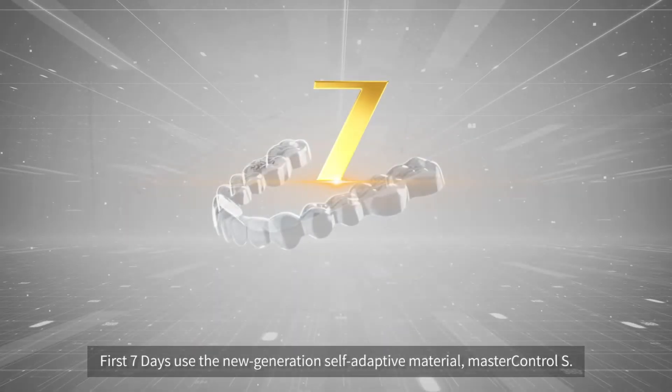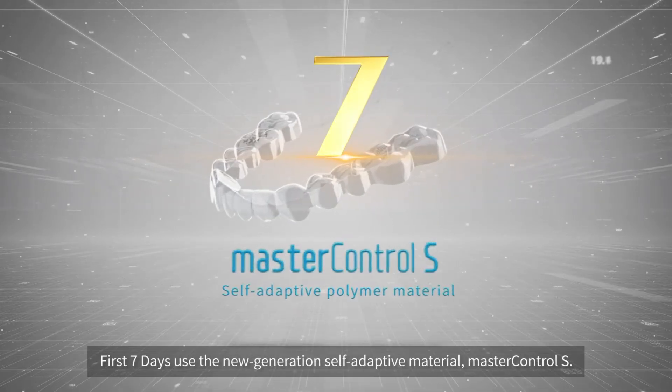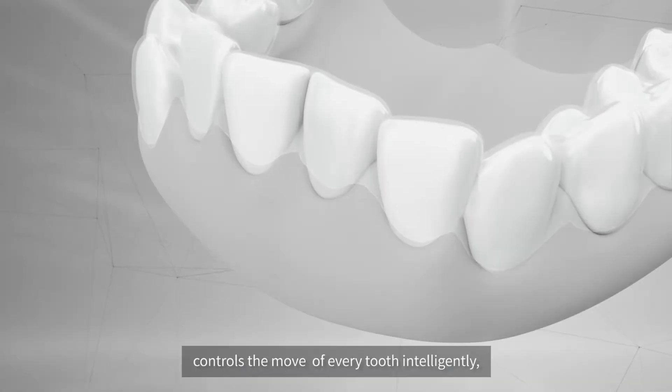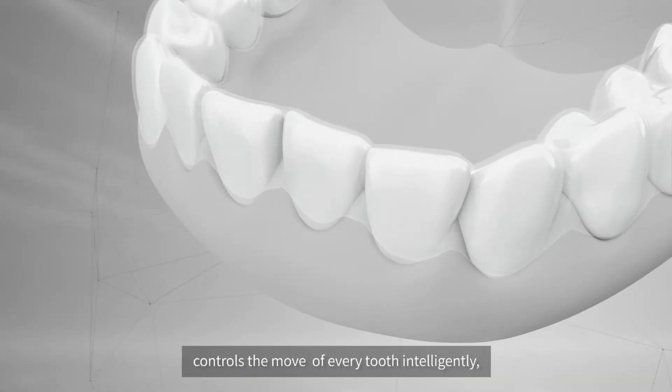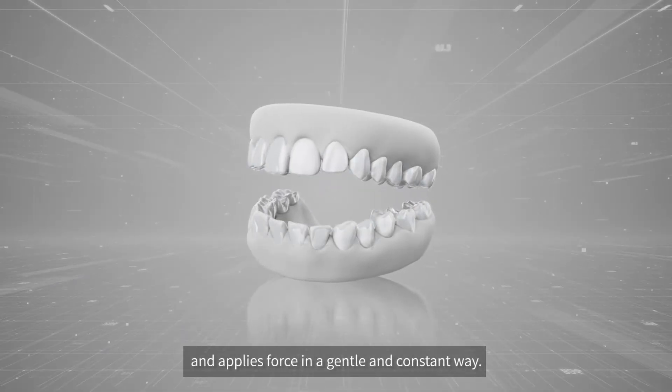For the first 7 days, use the new generation self-adaptive material, Master Control S. It combines rigidity and gentleness, controls the movement of every tooth intelligently, and applies force in a gentle and constant way.